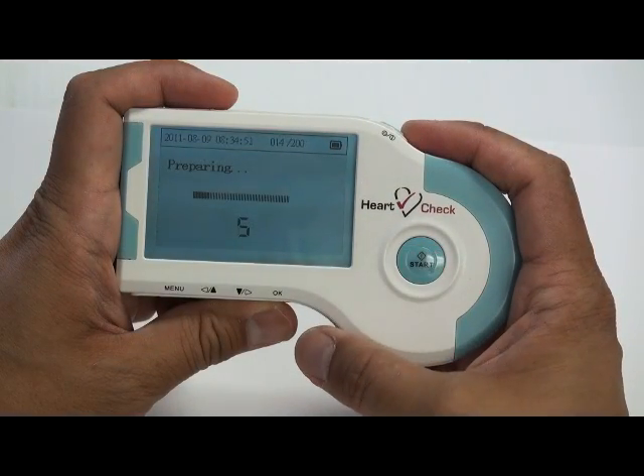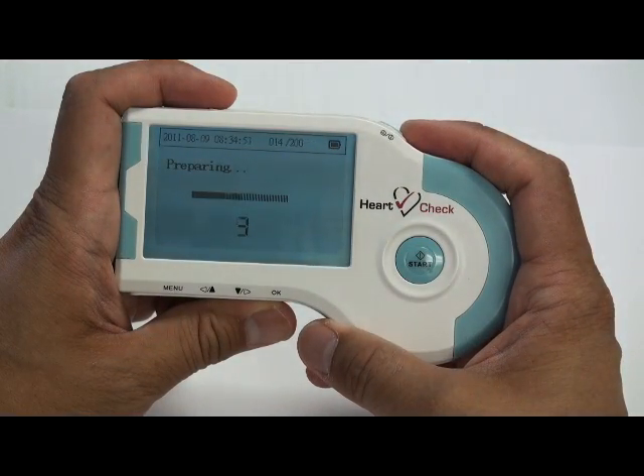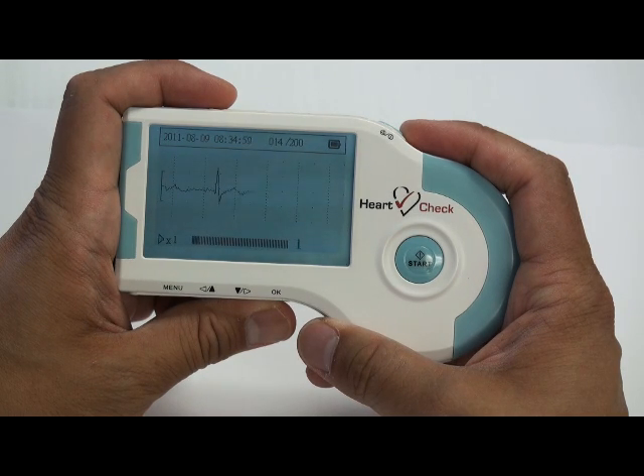After registering with the receptionist, patients will receive the ECG monitor, which is a handheld device able to continuously monitor the heart and to perform a quick 30-second simple heart rhythm analysis.